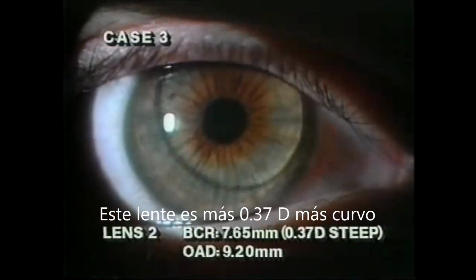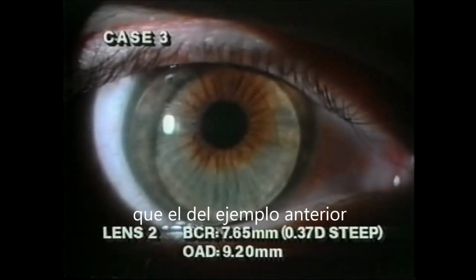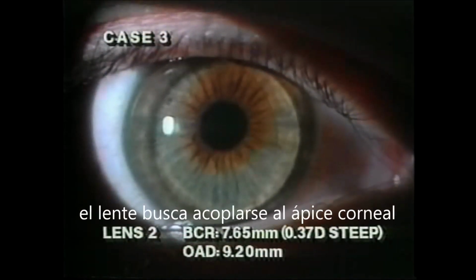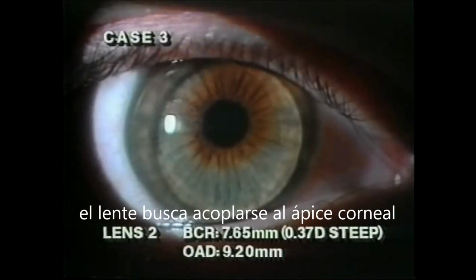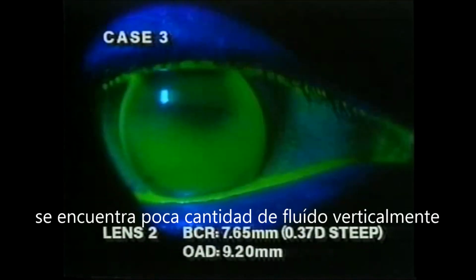This lens, fit steep, appears to present a better fitting relationship than the previous example. Decentration is not as excessive, however the lateral shift with the blink is still obvious. The lens readily decenters inferior temporally. The against the rule fluorescein pattern reveals vertical bearing and horizontal clearance.